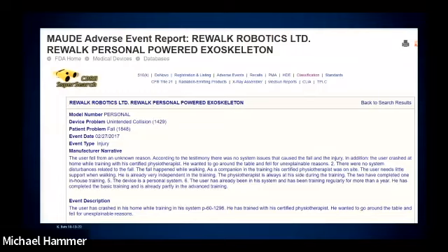And then the manufacturer is required to provide a narrative after their assessment of that report. In this particular case, I won't go through all the details, but they basically are documenting that the individual was trained, that they went through appropriate mechanisms. There were no system disturbances related to the fall. They go through that analysis, and then he has completed the basic training and is already partly done in the advanced training.